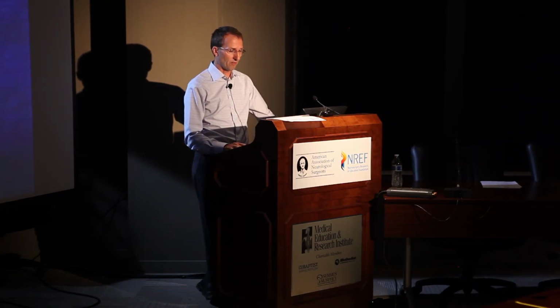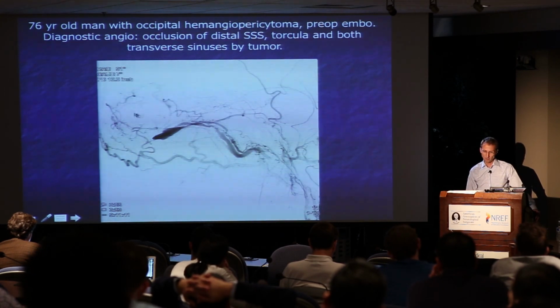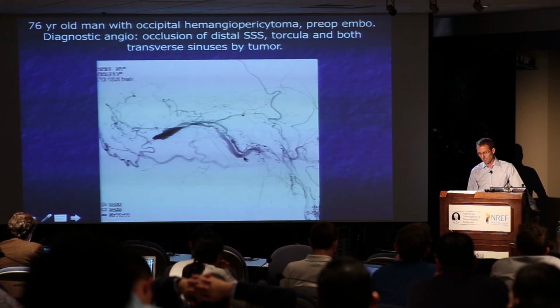And then if we look at the outflow of this, we see two things. This is retrograde cortical venous outflow here and here. All these are cortical veins. It's a little busy because this is actually going to end up being tumor supply, which you'll see in a minute. But then there is outflow down the sigmoid sinus down to the IJ.